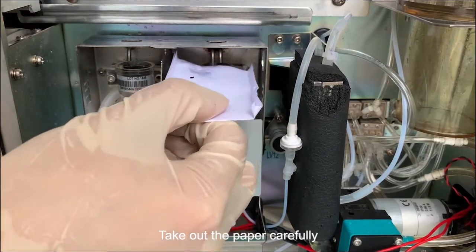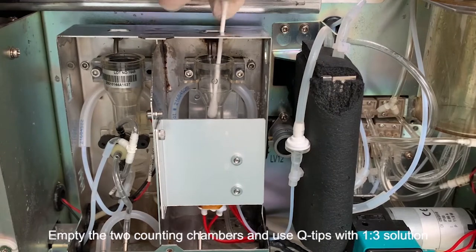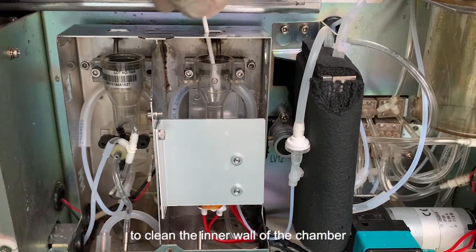Take out the paper carefully. Empty the two counting chambers and use q-tips with 1-3 solution to clean the inner wall of the chamber.